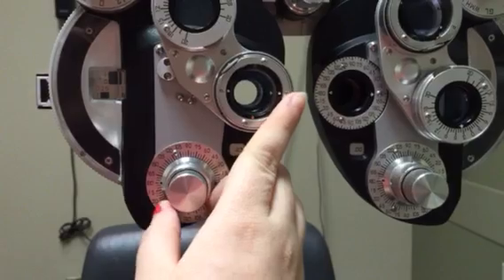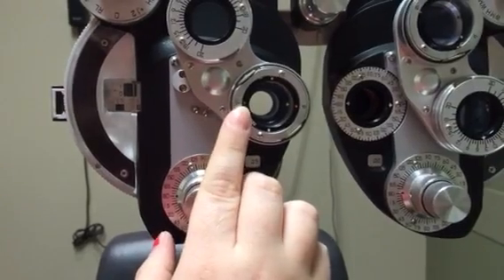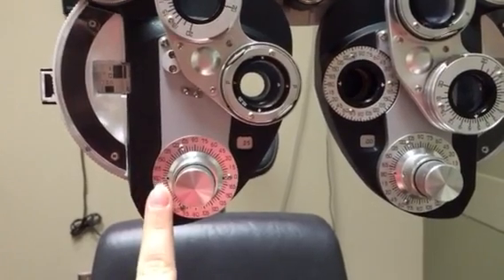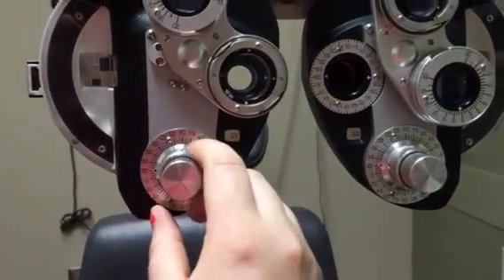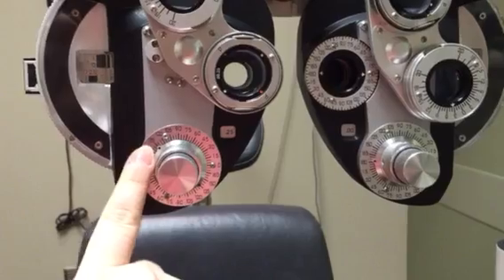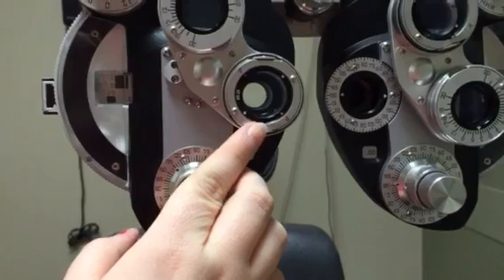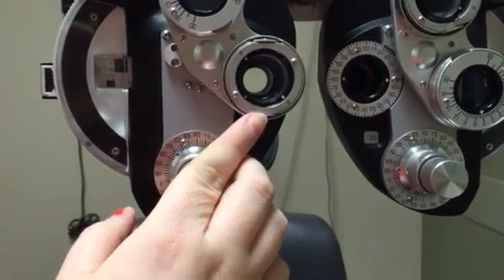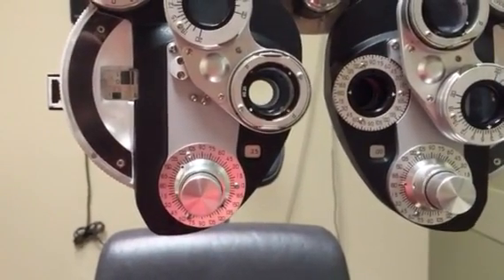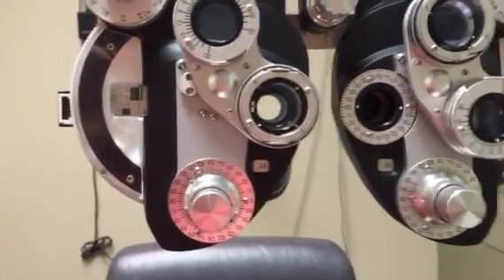Ask the patient: which is better, one or two? If the patient says one is better, that tells us they don't want power in that area of the dial. It doesn't mean they don't want astigmatism — just not there. So move to 135 degrees, align the axis indicator there, and ask again. If they still prefer one, the red side means stop — they don't want power there.